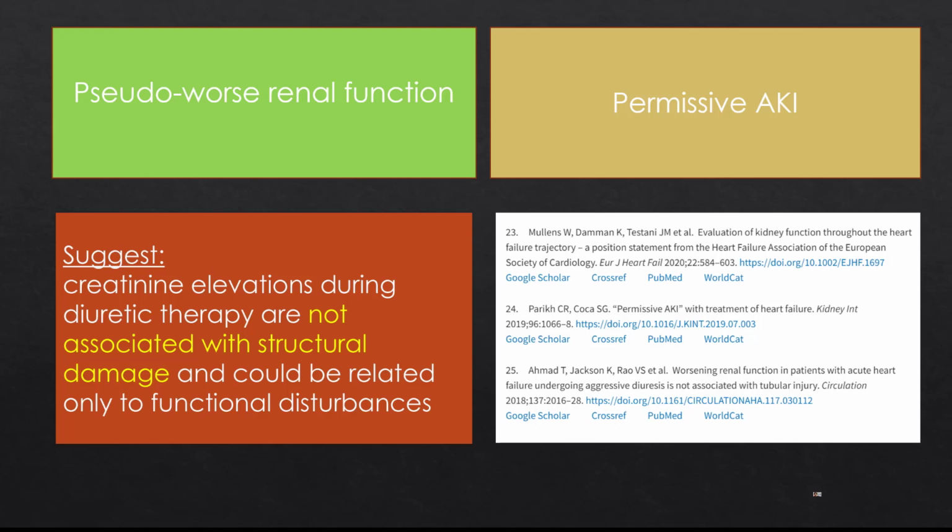So just a few things to pique your curiosity and to show you how point of care ultrasound is now moving to other specialties. The focus of this was to look at how we can use our ultrasound more to look at congestive heart failure patients, in terms of assessing them for tissue and vascular congestion to target treatment appropriately.